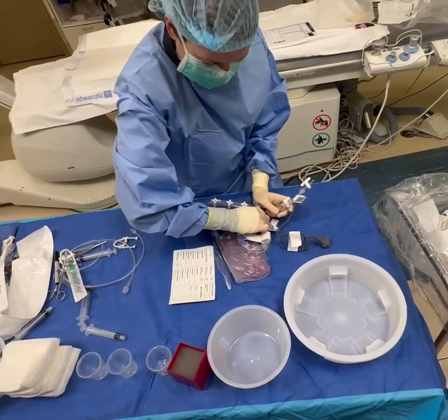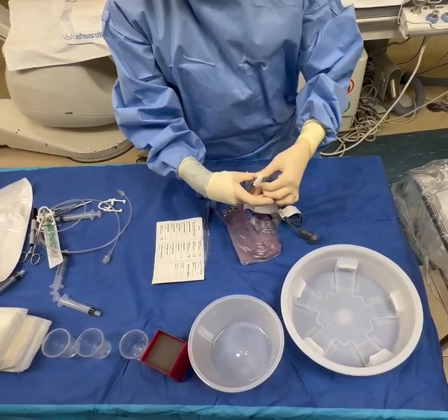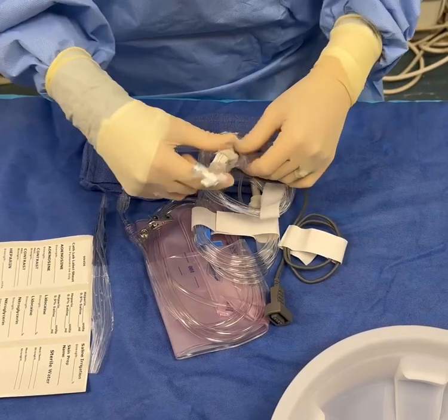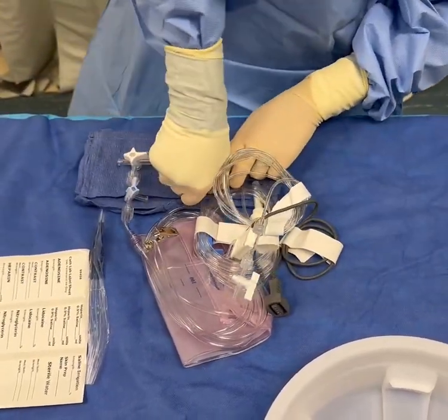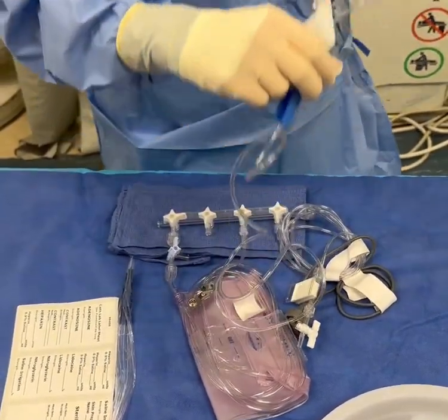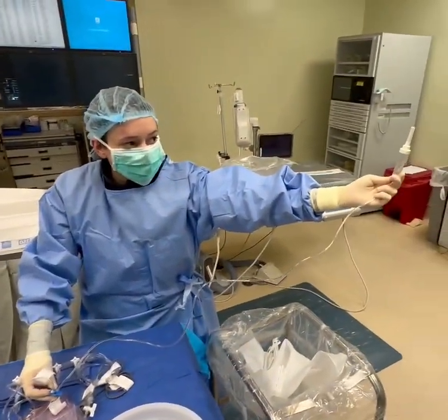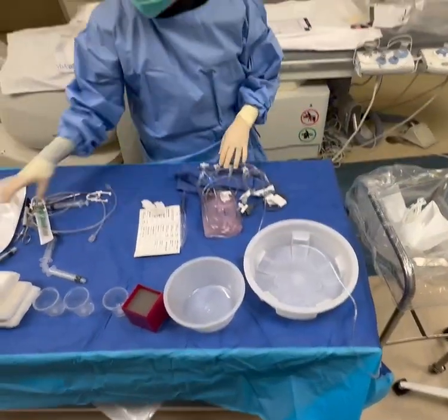It's measuring your pressure in your transducer. We're going to tighten every port, okay? Actually, you can get rid of this if you want to. We're going to leave that open because we're going to flush. We're going to tighten this. I'm going to pull this out. You can keep this down here. It lets you control if you want to. Once they hook it into the pressurized heparinized saline bag, that's where it's going to go. Okay, so I'm going to break that off.